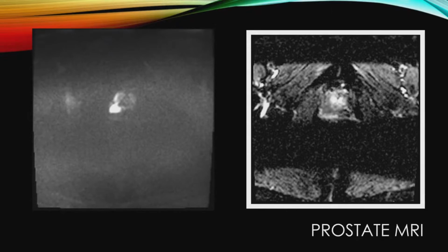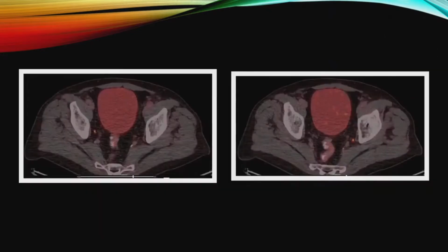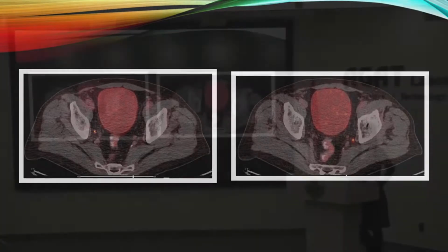However, given the elevated PSA, the radiation oncologist was concerned about metastatic spread, and this would be important for therapy, as it was a difference between systemic therapy versus radiation therapy. The PSMA PET-CT was performed, and indeed it showed prostate cancer in both the left and right aspect of the prostate gland. Additionally, there was abnormal uptake in the seminal vesicles, consistent with local extent of disease. And there were abnormal lymph nodes in the bilateral pelvis. So this identified disease that was not seen on CT or MRI.